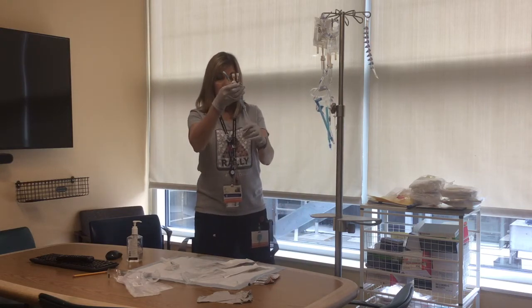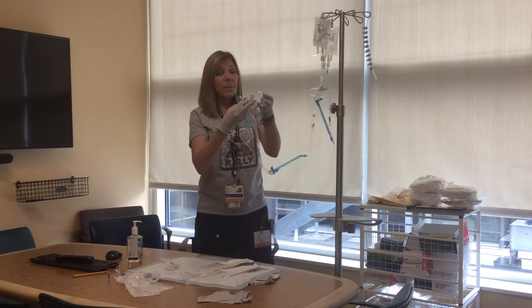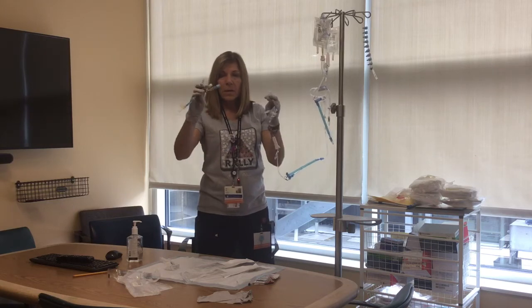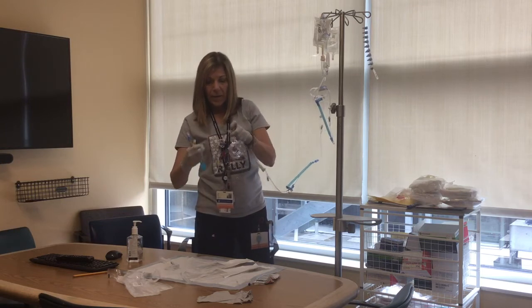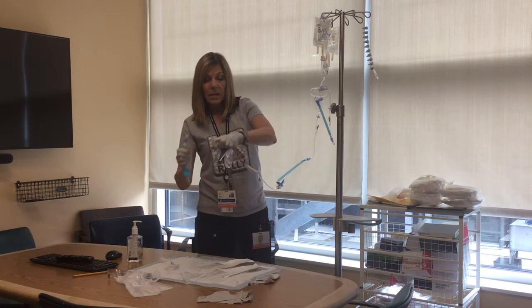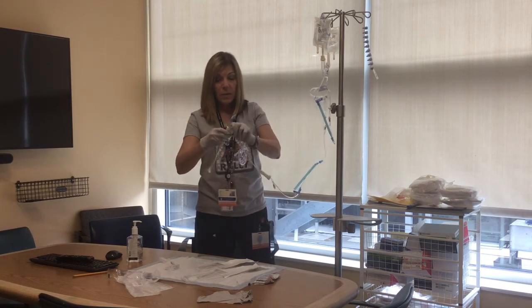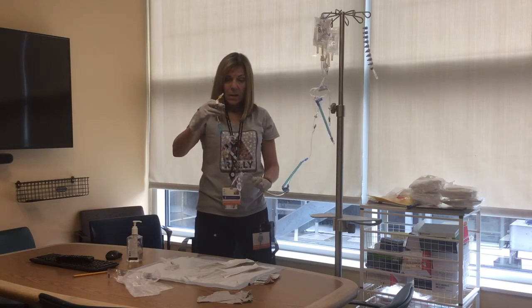Now you're ready to just prime the rest of your fluids through. You can start with your lipids and hook that right up there. This does away with needing extra caps — you don't have to touch the line as many times as if you were putting caps or needleless connectors on and having to flush it multiple times. Go ahead and prime that up.